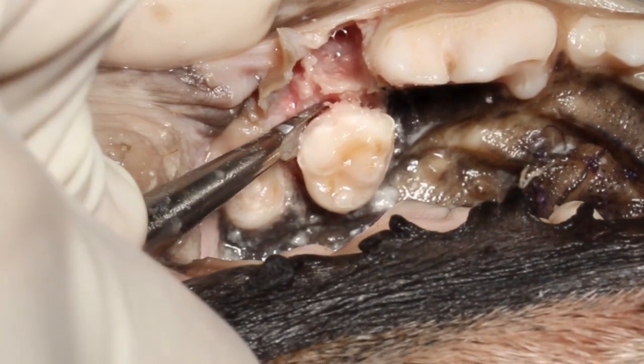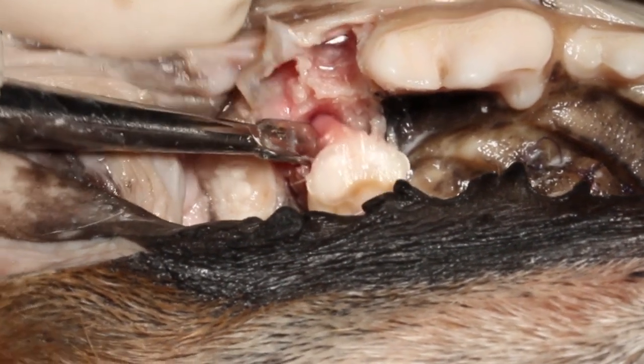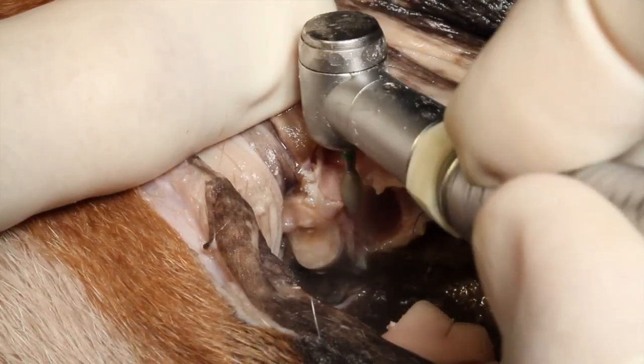As an added bonus, here is how we would place our luxator to extract that palatal root. It's a very large triangular root — very thick and very difficult to fracture — so it's a pretty easy extraction from that point.